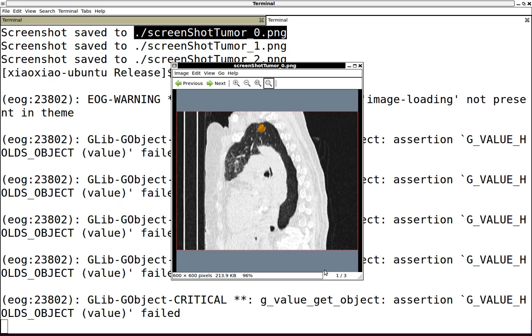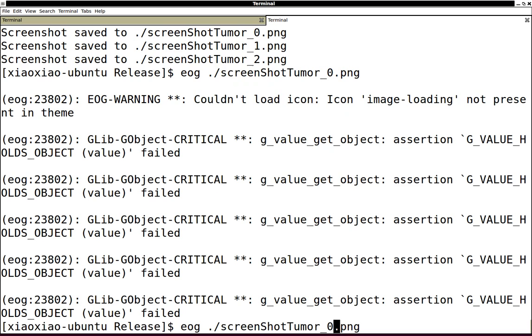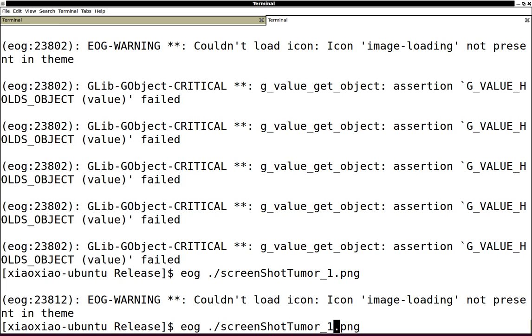So it looks reasonable. This is a coronal slice, and this is the axial slice. Alright.